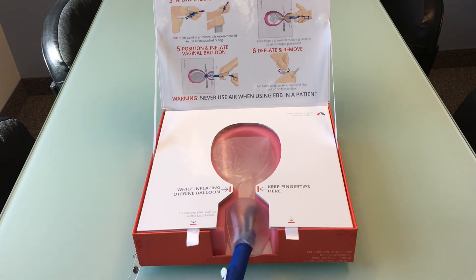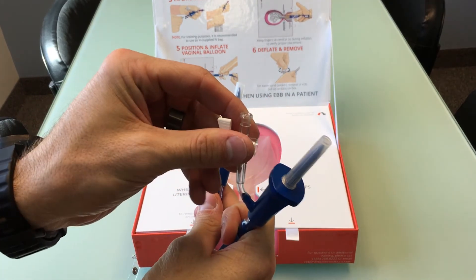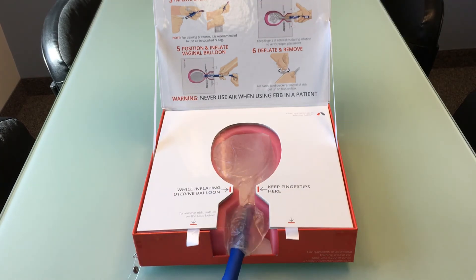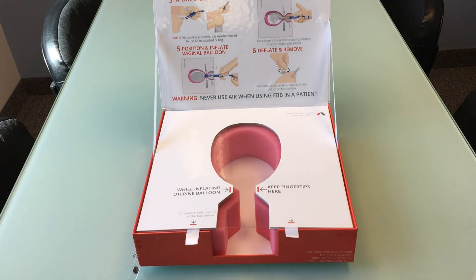To remove the device, simply open both of the stopcocks and wait a few seconds for some of the air to release. After a few seconds, use the tabs on the lid to open the top and then remove the EBB device.